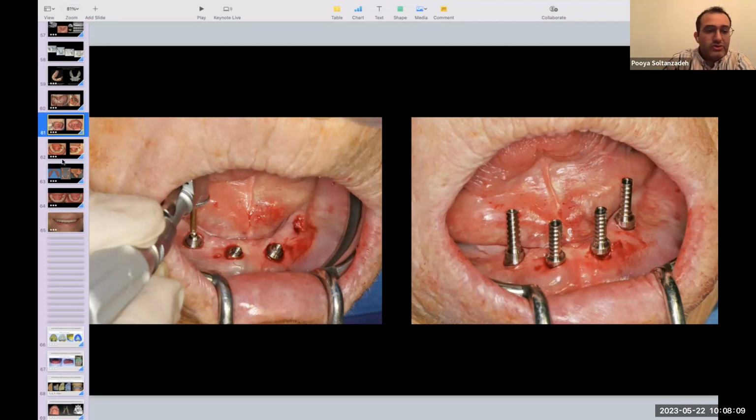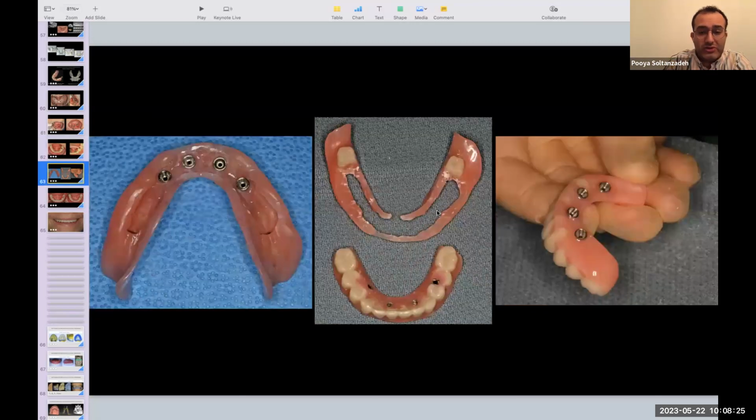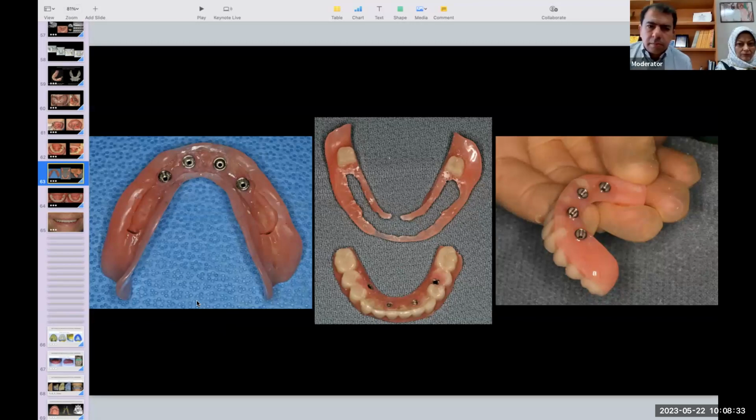And the denture is also pre-cut. So basically you put these temporary cylinders in, and they're already sticking above it. Then you only pick it up, cut it, unscrew it, and fill it up. So maybe the conversion part can take another 2 hours maximum. So nice. I would say with fully guided, you can have everything done within 4 hours.